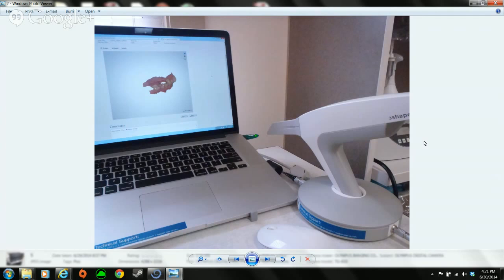We actually did an all-on-4 surgery the other day. All 4 implants placed with a Blue Sky all-on-4 plan and angle correcting abutments in about 13 minutes on an all-on-4 case.